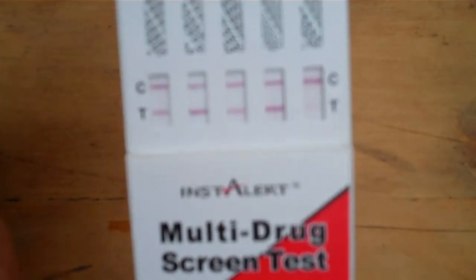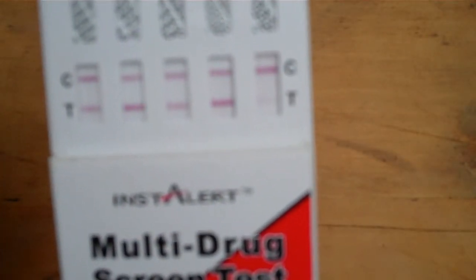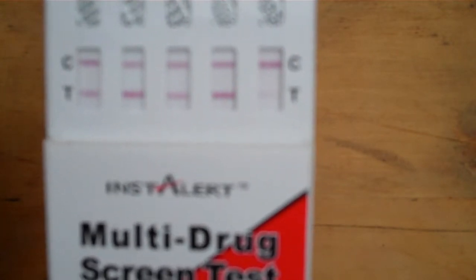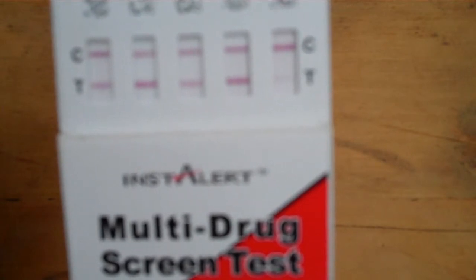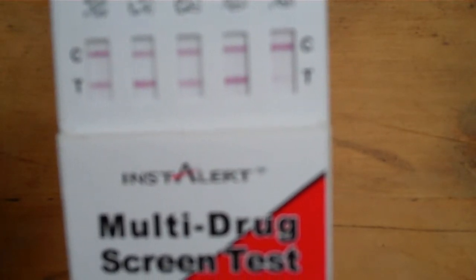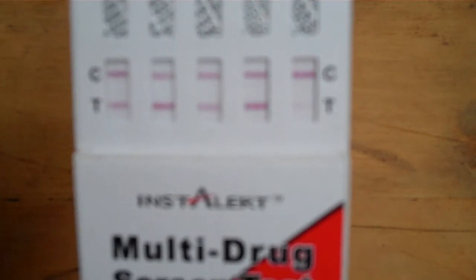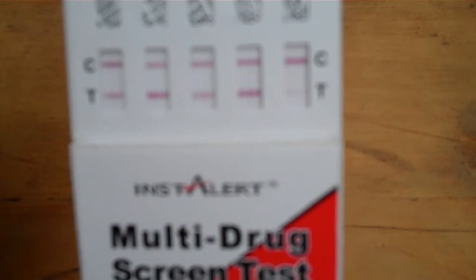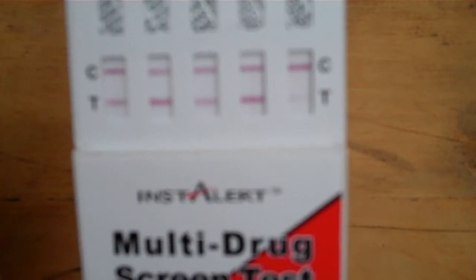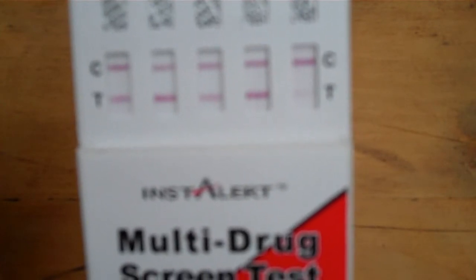If we have a look at the TCA line here, which is the one furthest to the right of your screen, you'll see that the test line showing on the TCA membrane is very much fainter than the corresponding BZO test line in the panel window next to it. Now that is of no consequence whatsoever in terms of the interpretation of your results. You have a discernible test line there showing, and as long as you have that at the 10-minute cutoff, you must interpret that as a clear negative result.